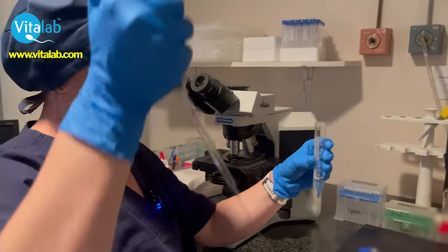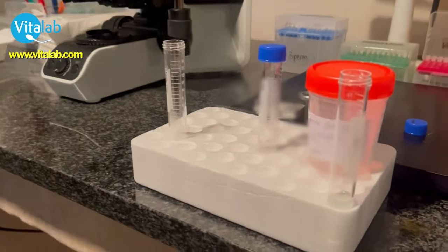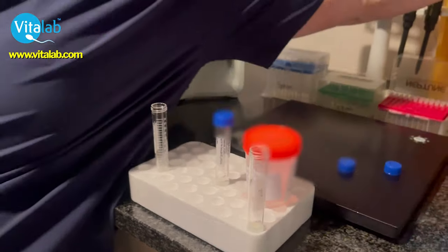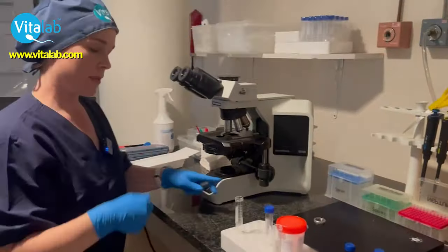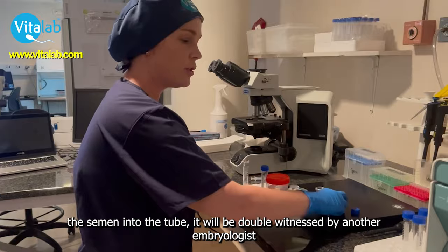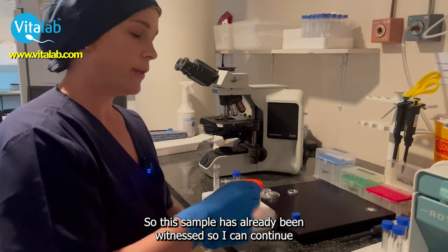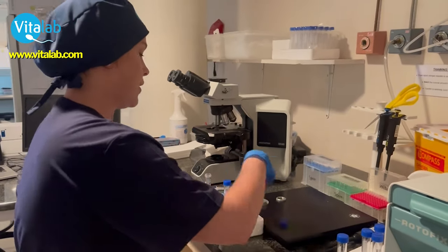So I'm going to take a look at this. Before we transfer the semen into the tubes, it will be double witnessed by another embryologist. This sample has already been witnessed, so I can continue.